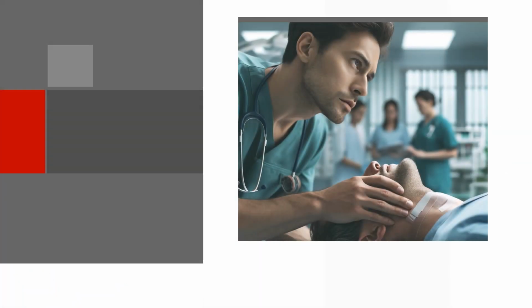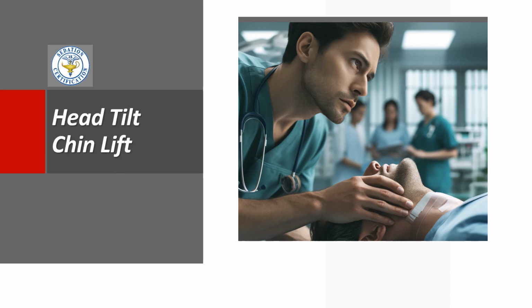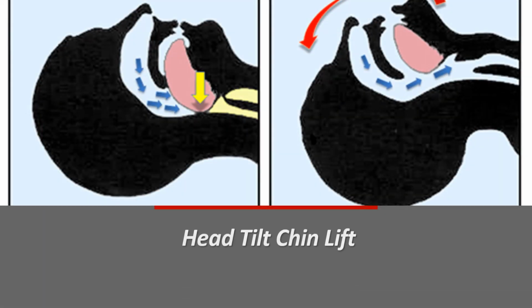And sometimes we start here, do a head tilt, and here's what happens. All you're doing is getting that tongue off of the top of that epiglottis so air can get into it. Does that look pretty simple? That's the simplest thing to do. Also, when you do that, guess what else is going to happen? It's going to stimulate them to kind of wake up. And don't just reach up there; say, Charlie, you're going to feel my hand on your chin. I'm going to have you look up here at me. And you'll start breathing better.